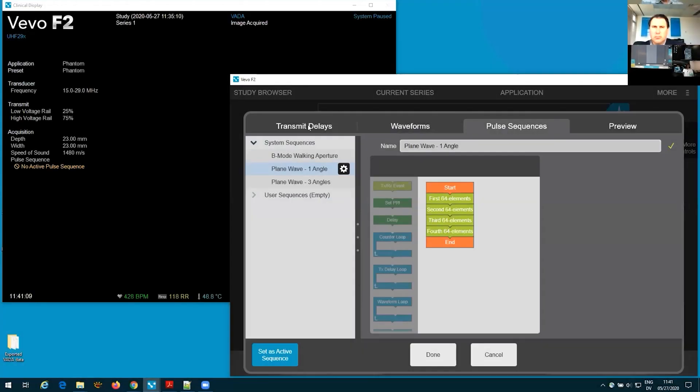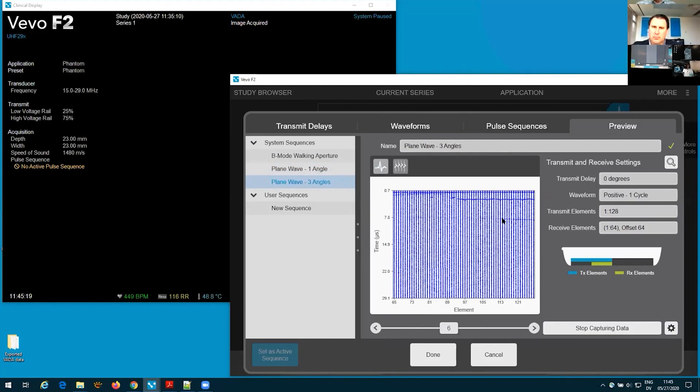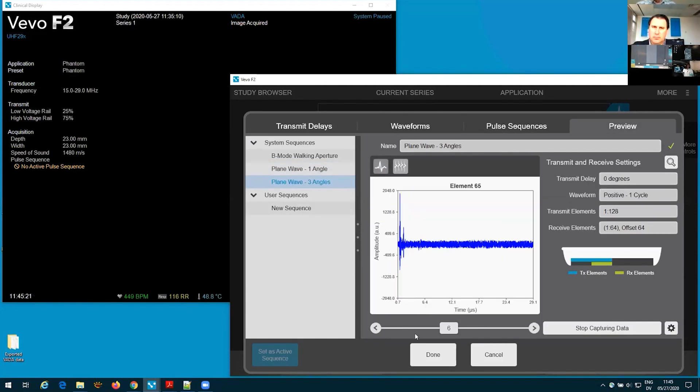Here's where we can take our transmit delays and waveforms and put them together into a customized pulse sequence. We're now seeing everything at the aperture level, and we can go down to the individual element level.